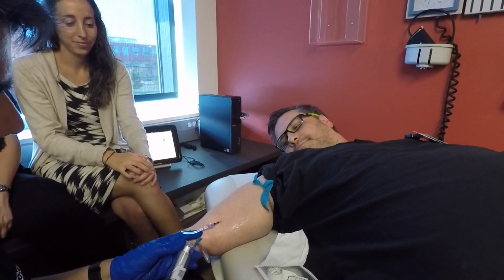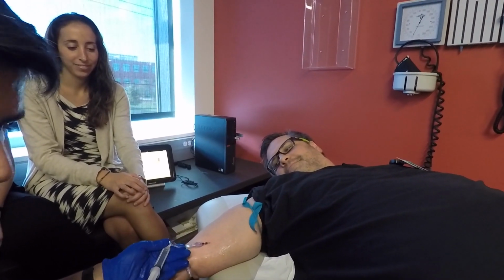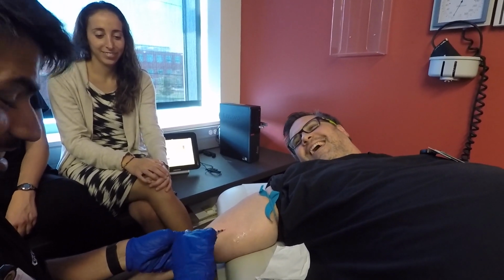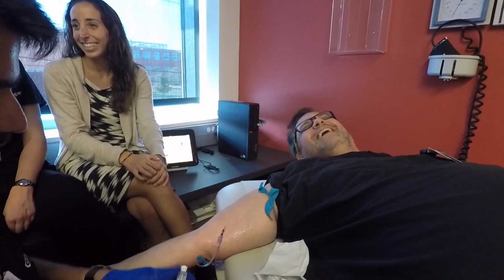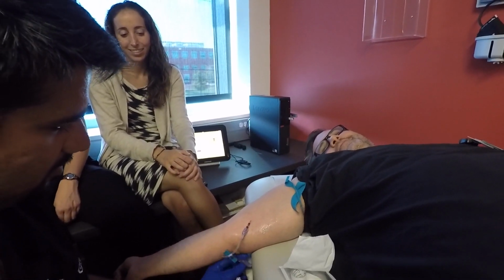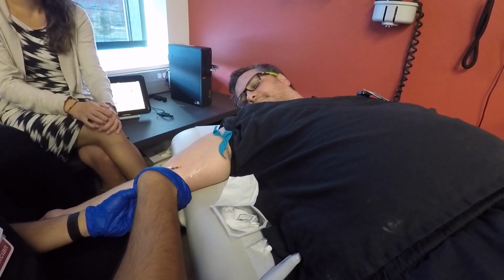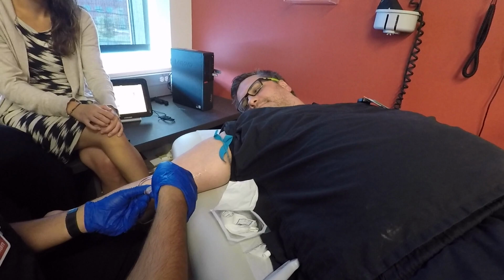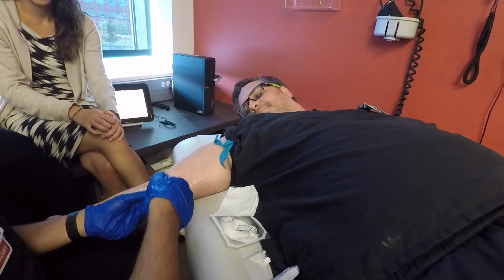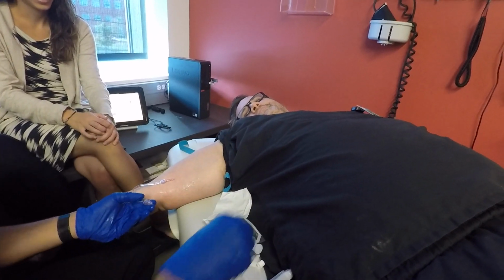Always remember to draw back on your catheter once you're done. Don't give me an air embolism, dude. Which is why you draw back once you're done, to make sure that you get the air out of the line. So you can open that. So draw back, see a good amount of blood, and then you can inject. And now Dr. Byrne can get a bag of fluids to ensure that he can finish the session.